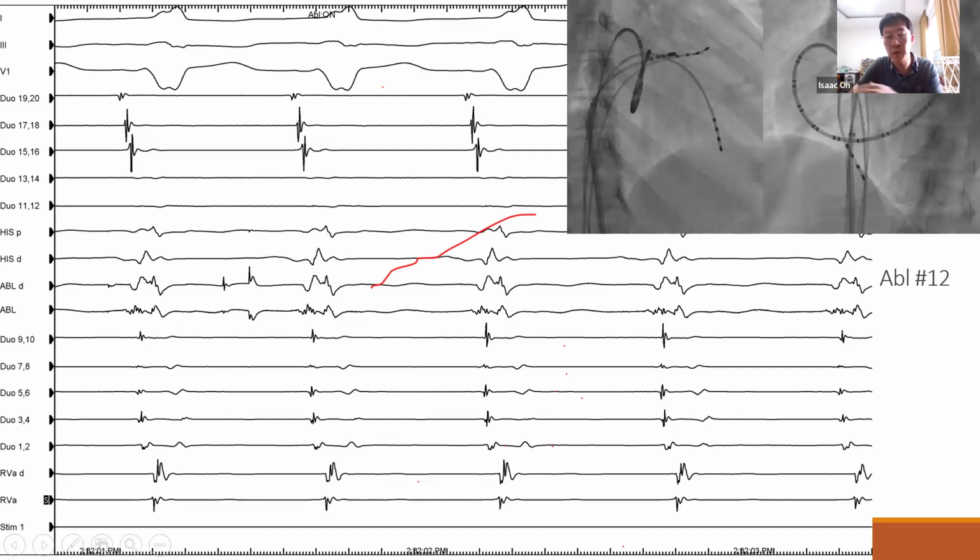So I think so, but the problem was that I was not very confident, and I was worrying about the AV block, so I could not deliver for a very long time or at very high power near there. So we tried some good points with low energy and very short time, hoping to see some sequence change, and I wanted to deliver for some more time.